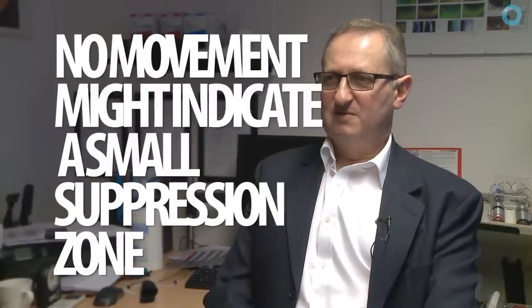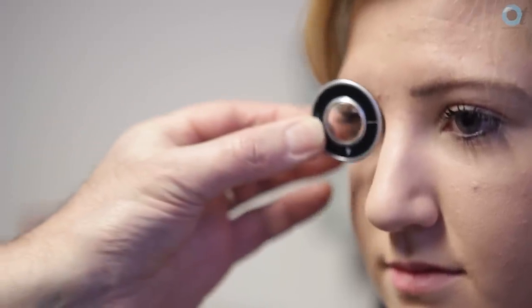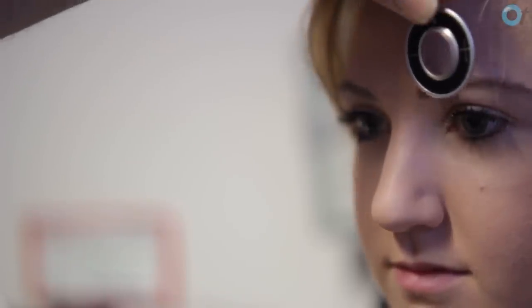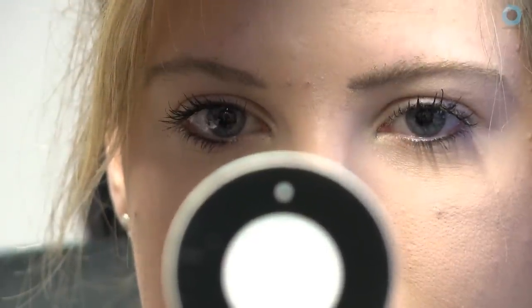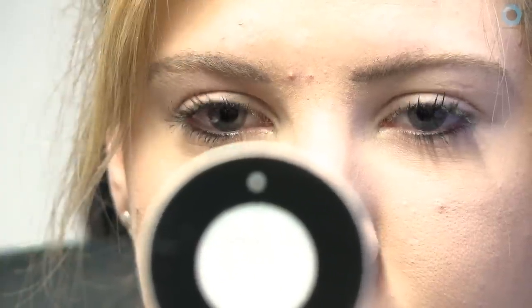Beware of those patients on whom you see absolutely no movement, but who appear to have marginal visual issues. Those patients may have a small suppression zone centrally, and the best way to detect that is by using a four-prism base-out test. Simply get the patient to fixate the most appropriate target, insert a four-prism diopter lens with its base outwards, and watch for the eye movement. I find it quite difficult to see much eye movement when you put the prism in, but when you take the prism out, you should see the movement go in the opposite direction.